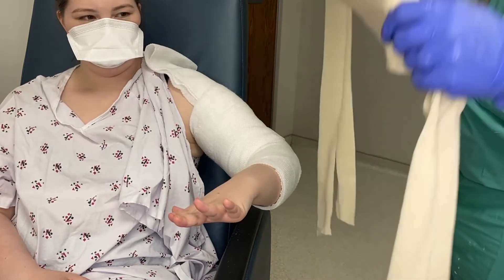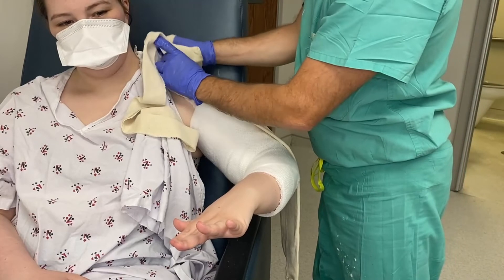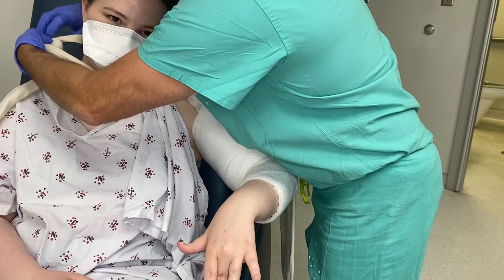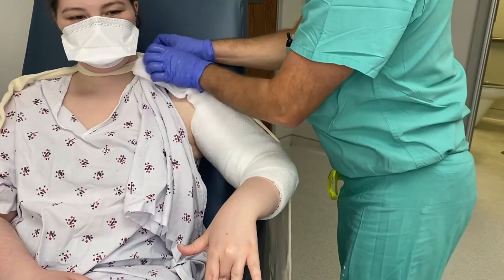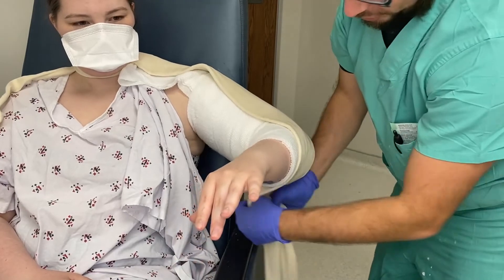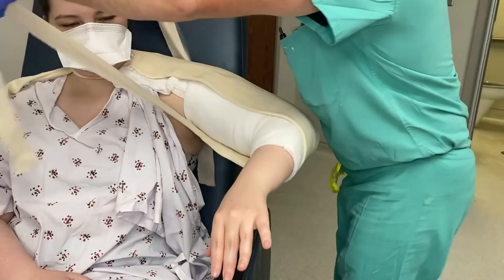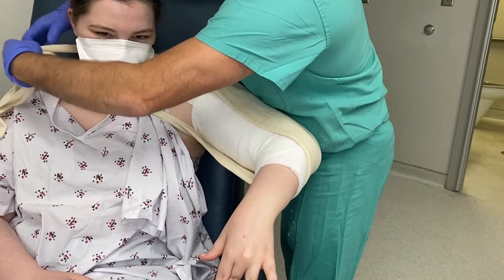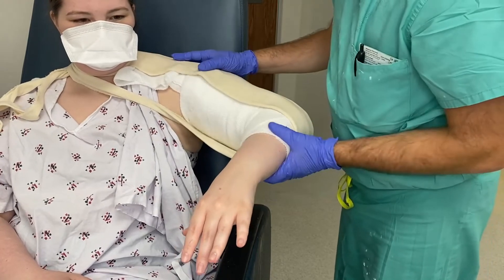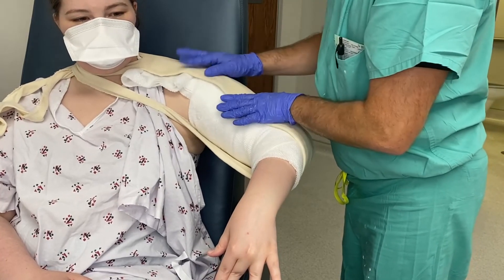What I usually do is find my longer end and then go up high next to the patient's neck and tie this around their neck loosely — not tight. It doesn't have to be perfect. Usually I do a slip knot and then position the plaster. This works just like a sugar tong. Go from the armpit and tie it around the neck again. Reassure the patient that this is just temporary while the plaster is hardening. The reason I do this is because after you apply the splint, the splint will slide down the arm, so this just helps it dry while it's in place.